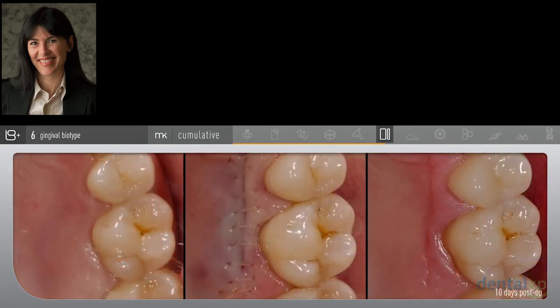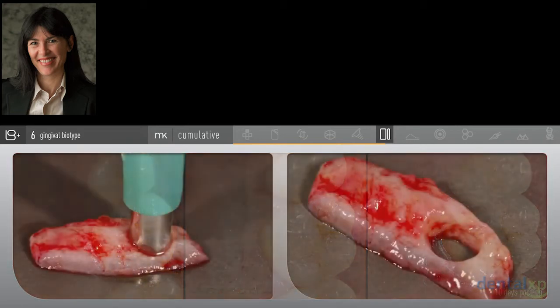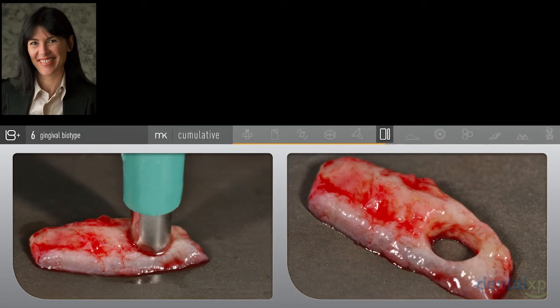But I'm going to tell you that I don't always. This is very early into the healing process, but I'm going to get some patients that come in with very slow healing. And in fact, you're going to see much more of a cave or a cavern, and tissues have to regenerate. Everybody is a little different in terms of how they heal. But our goal is to get great tissue quality. So when you look at these grafts, this is excellent fibrous connective tissue. That's going to produce a great graft no matter where I put it. If it's around teeth, around implants, it doesn't matter.